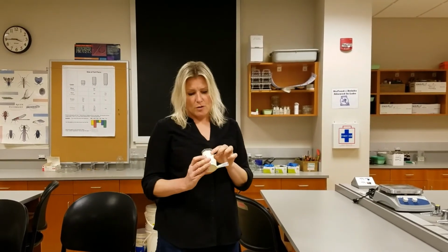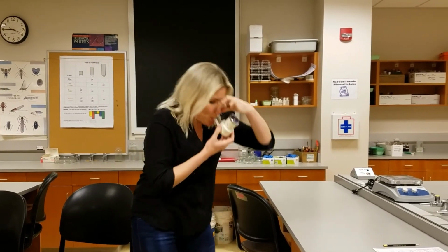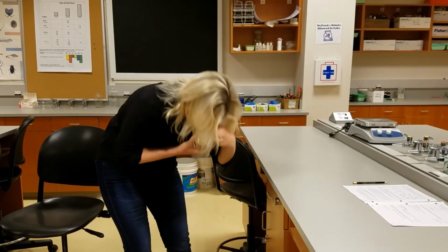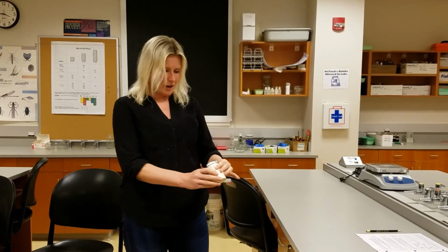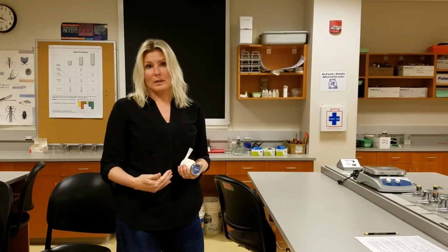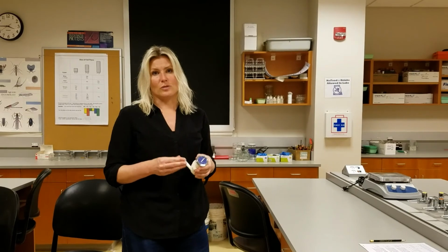All right, so I'm going to demonstrate this. All right, I had 4,100 cc in that blow. So you would just do this 3 times, calculate the average, and then you would do the other volumes as described in your lab manual.